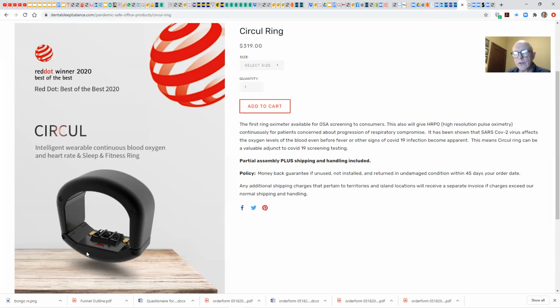You can't do that with a home sleep study. Once you give somebody an HST, it's out. You don't have any more to give out for the day. And also, they might keep it for a day or two before you get it back. You may be able to do 1 or 2 patients a week, screening them for sleep apnea. What we know is people are interested in this because it's free. We hand it out at no charge.